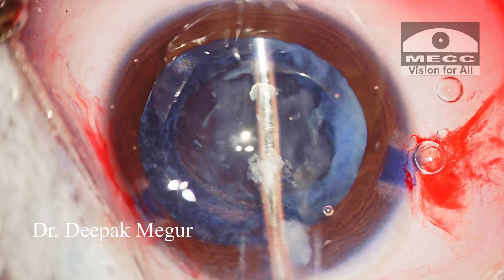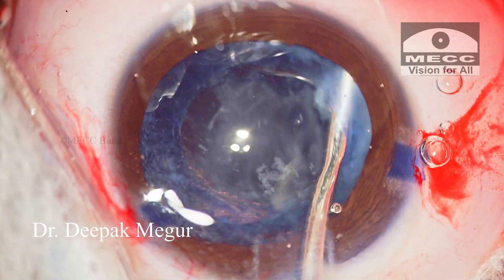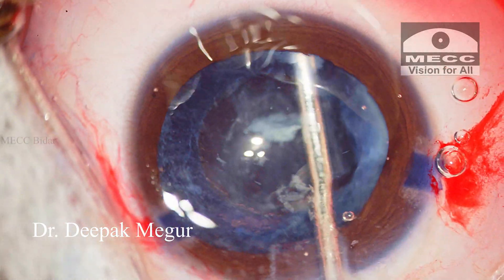Now I can see that the posterior capsule is quite thickened and probably has an overlying thin fibrotic plaque as well.